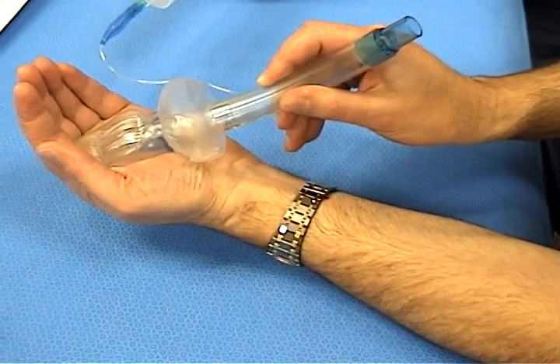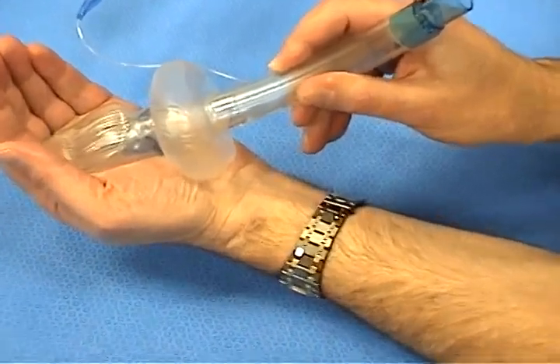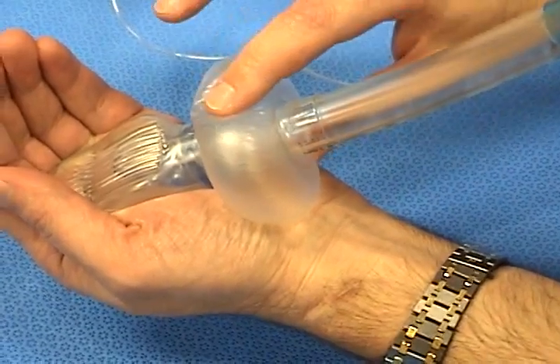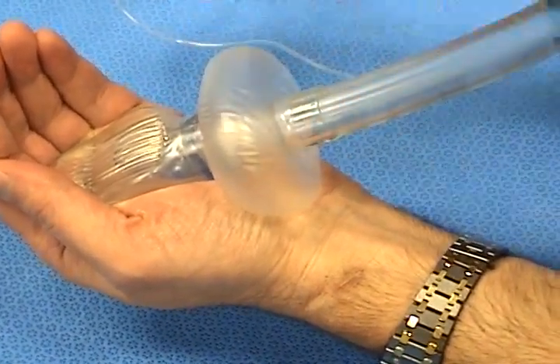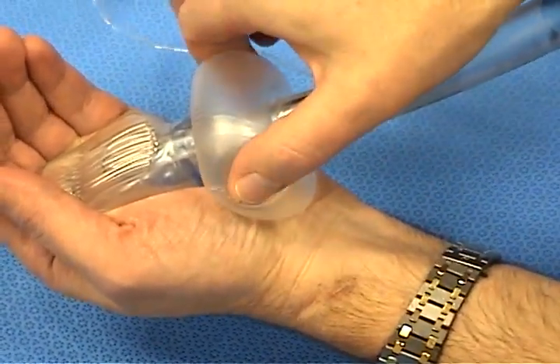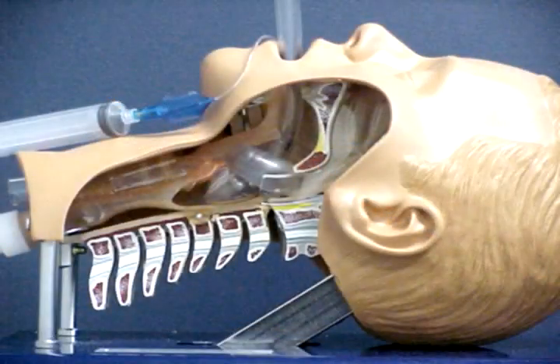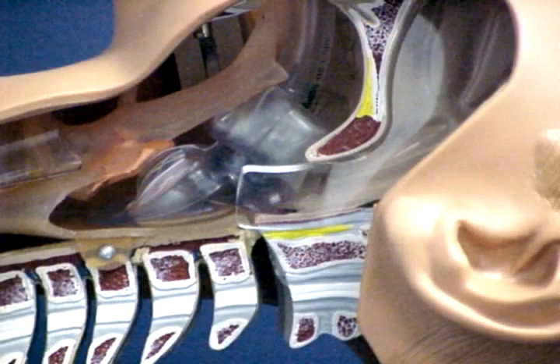The cuff is anatomically shaped and seals the oropharynx. It's more effective than other supraglottic devices that seal the side of the hypopharynx. This model shows how the Cobra head and cuff are positioned in the hypopharynx. Note that the cuff is inflated in the proximal hypopharynx, having turned around the back of the mouth and tongue, and that the grill approximates the glottic opening.